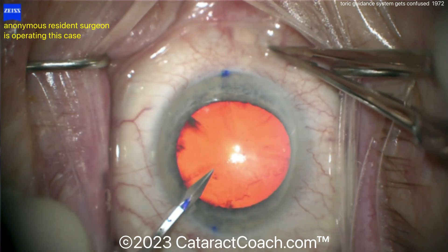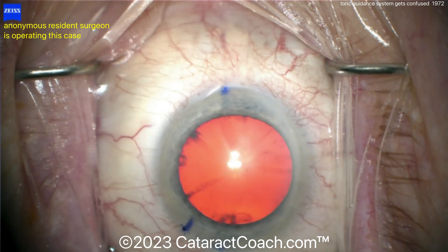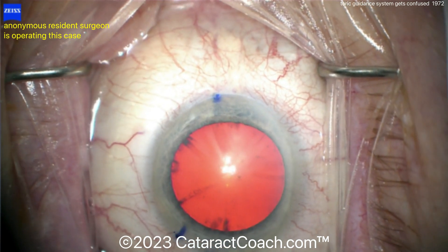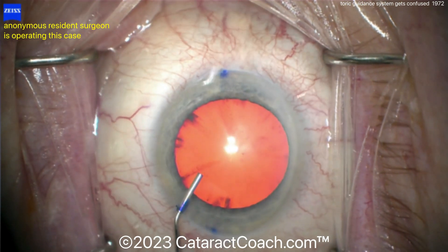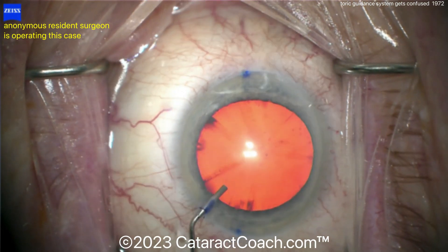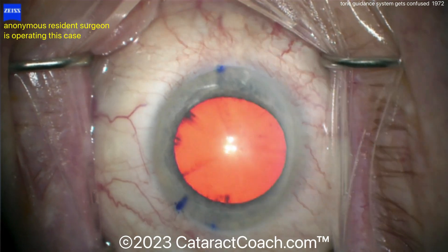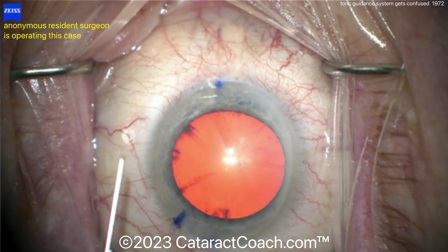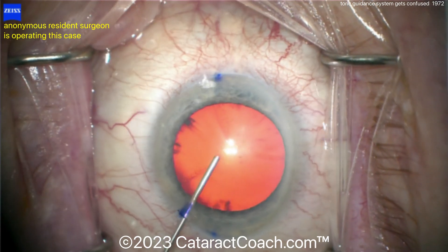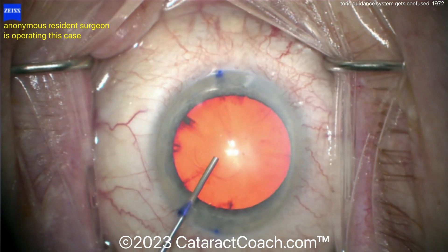The surgeon has inked the blade so that when the paracentesis is made, it's easy to identify where the paracentesis is. That's a move done often by young residents who are learning to operate. The problem is, this machine is going to use those blue ink marks as guidance for where the 180 is, and then it's going to tell you how to put the toric lens in. So now there are three ink marks on the cornea, and the machine is going to become confused.